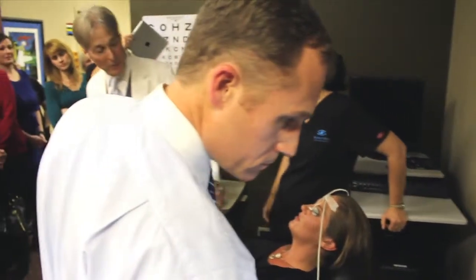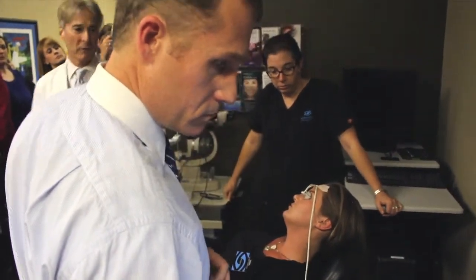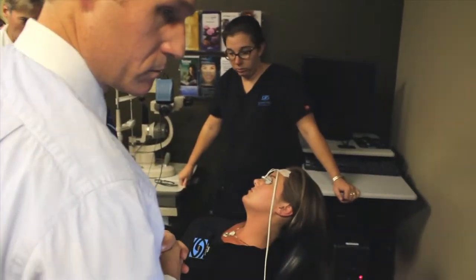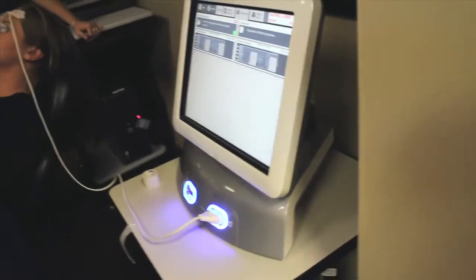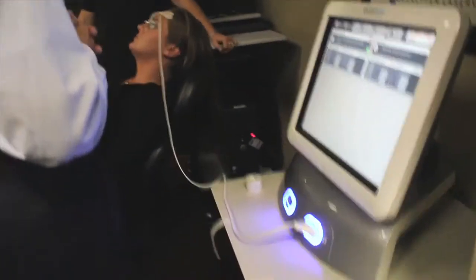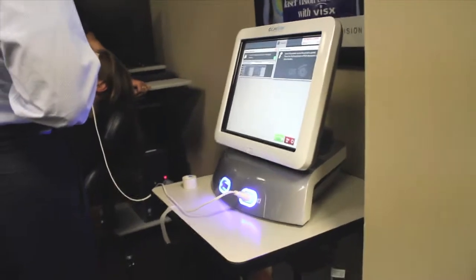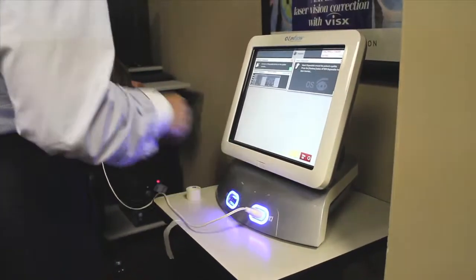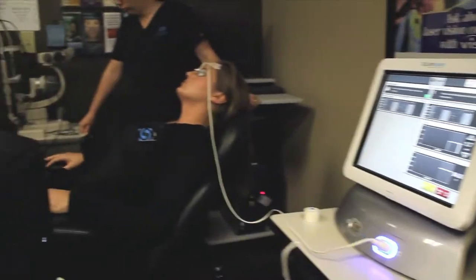So you remember the drawing, so you can see it's in her eye. So now we tell them that you will hear sounds first. If y'all come around and watch the screen, I want everybody to see the screen. You're going to see as it starts turning on, it's going to start heating up. That sound you hear, that's air going into the bladder, and she can feel a little bit of squeezing, but it doesn't do anything yet. And as she hears that air, it's going to warn, okay, now it's coming, and you feel this, and it just feels very good.